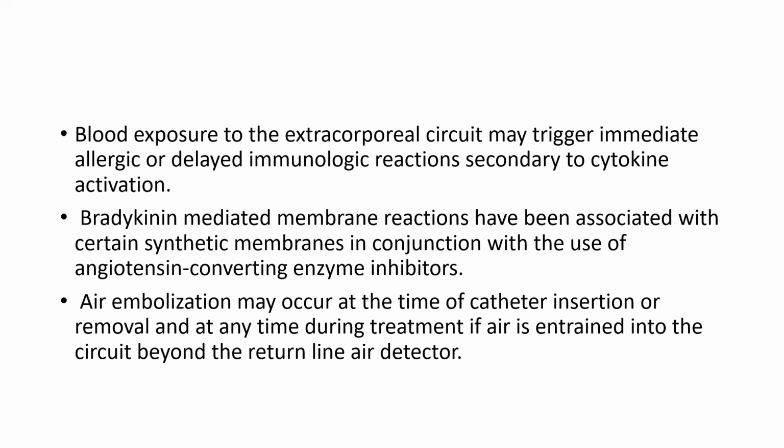Bradykinin-mediated membrane reactions have been associated with certain synthetic membranes in conjunction with the use of ACE inhibitors. Air embolization may occur at the time of catheter insertion or removal, or at any time during treatment if air enters the circuit beyond the return line air detector.